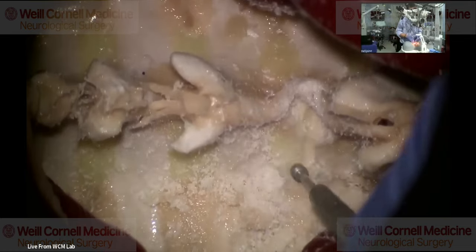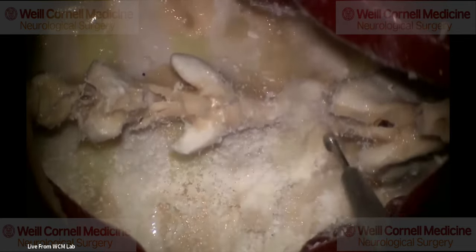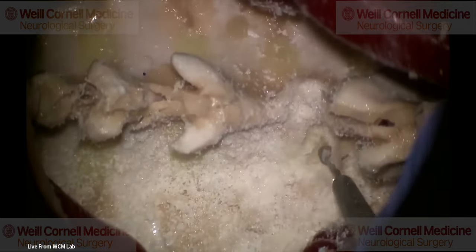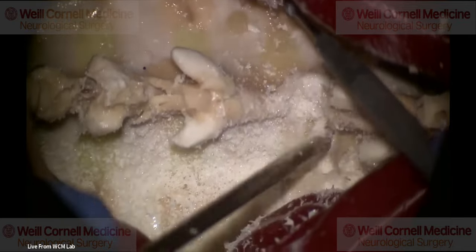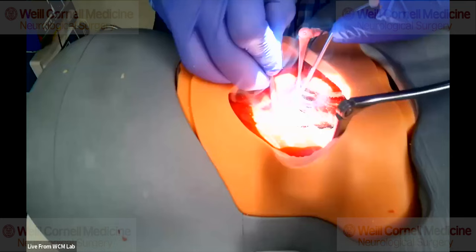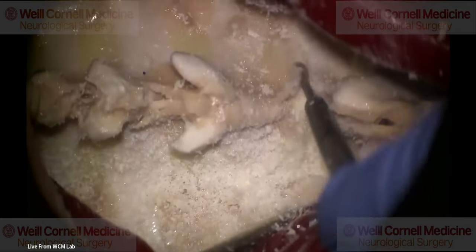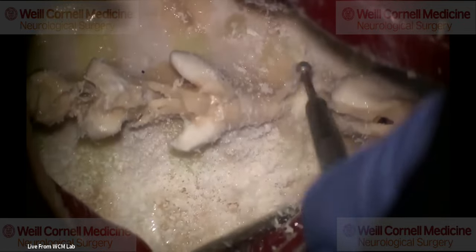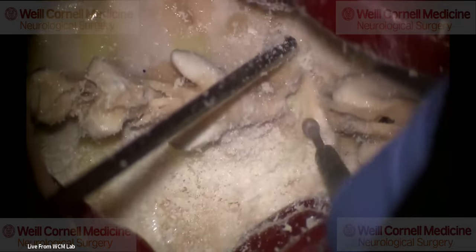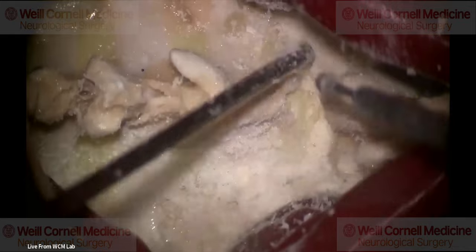And the ligamentum flavum goes up about 2/3 of the distance behind the C3 or any of the laminae in the cervical spine. So I'll take some of that away. And same thing on the other side. Now, you would usually use about a 2.5 millimeter carbide tip matchstick burr. So this is a little bit bigger than what I would use and a little bit rougher, but it works.